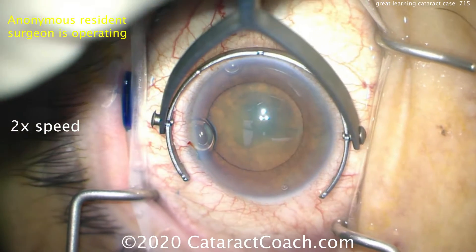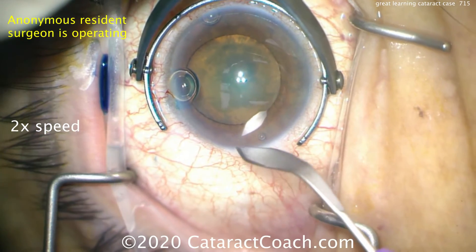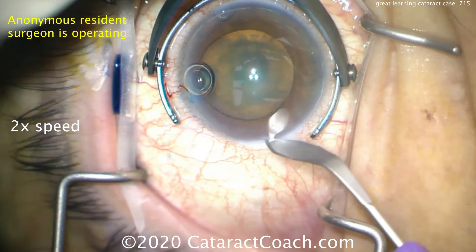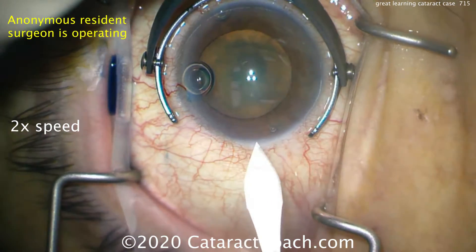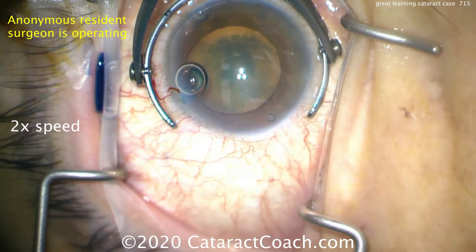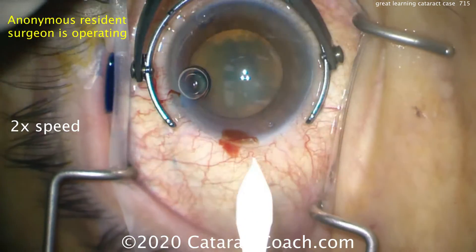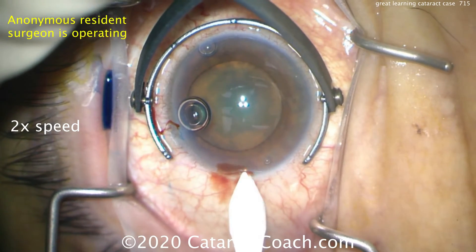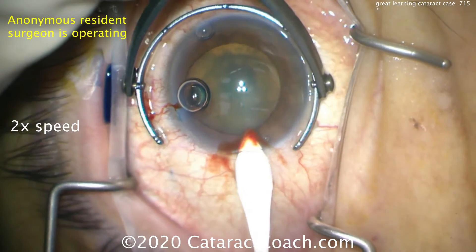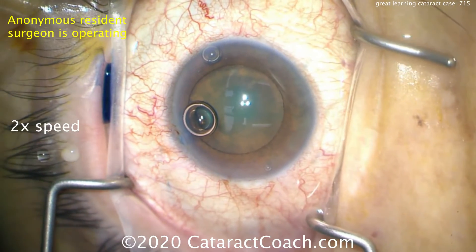Here comes a fixation ring, and here comes a keratome, making a temporal phacoincision — not in the clear cornea. I want it to start just at the limbal edge so it barely nicks the limbal vessels. Making a little indication where he's going to start. Starting with the blade, readjusting — this is normal for a resident to take their time and get it right. There's the incision now, good tunnel length, and now entering the AC. Very nice incision.